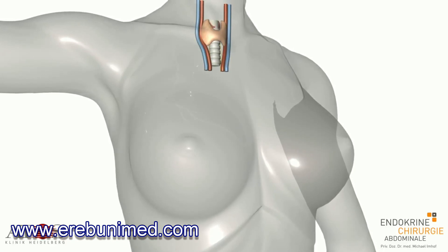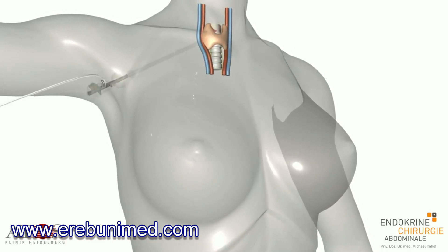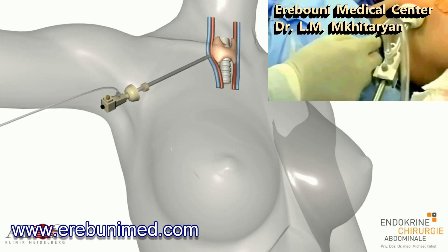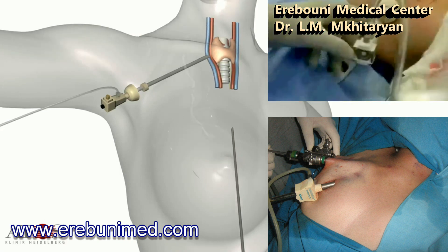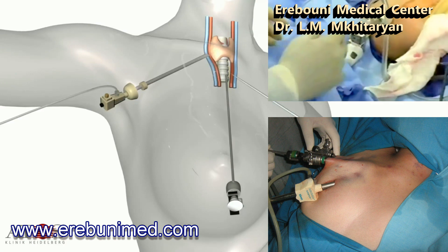A special trocar, 10 mm in diameter, is then inserted and CO2 is pumped through it to create the necessary space for the procedure. A small 5 mm incision is made at the edge of the areola of the nipples, and fine trocars, 5 mm in diameter, are pushed through under the skin until they lie under the neck muscles.